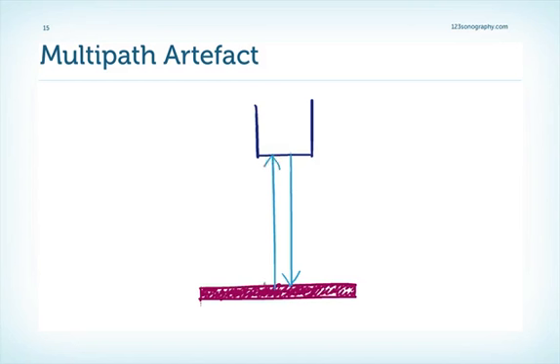But then we could also have a ray which is diffracted towards another structure, and from there it bounces back to the transducer. In this situation, the ultrasound machine is fooled and it will portray another structure which is further away than the actual structure, because the path that aberrant ray took is much longer than the actual distance between the original structure and the transducer.